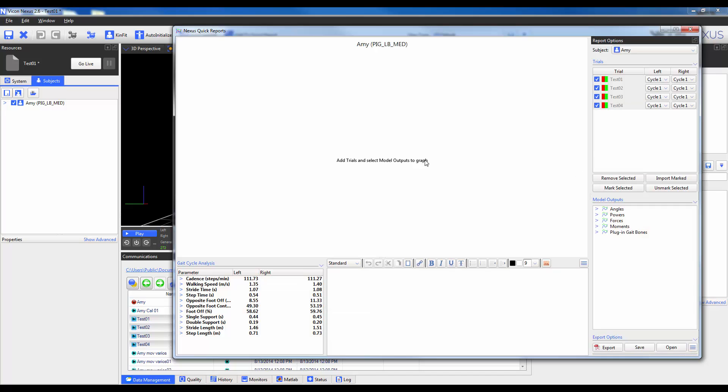Keep in mind that this method of marking nodes requires a C3D to be present. In all methods quick reports will be looking for model outputs to be calculated and/or events to be identified in order to contribute to the report.